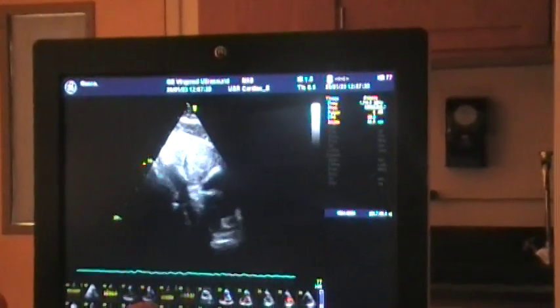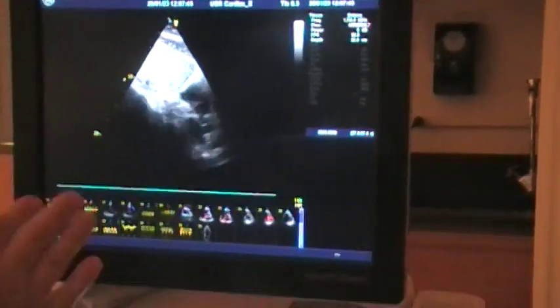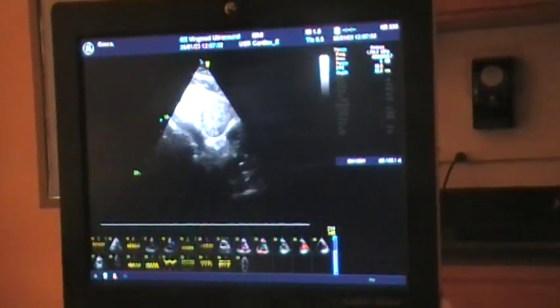And if I angle towards the patient's left, I'm going to go through each of the levels again. So this is mitral. Taking a breath and hold it. This is papillary muscle level and apex. The reason you want to know that is because if they don't have a good window for peristernals, like if they have emphysema, you might have to do most of your echo from subcostal. So, yeah, it's not fun, but it can do it.